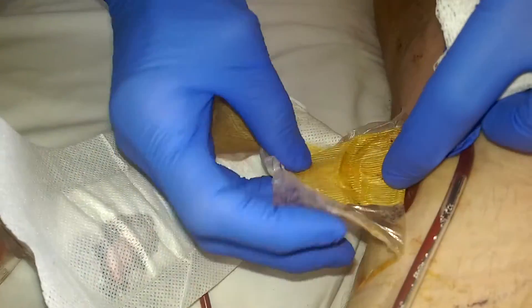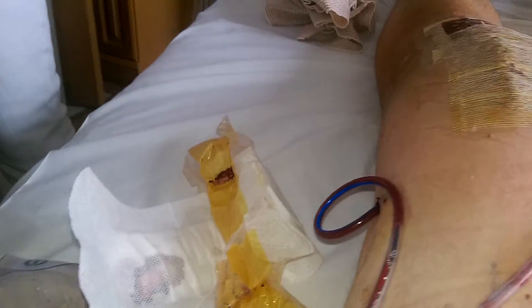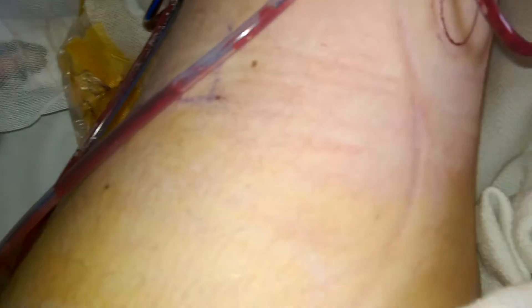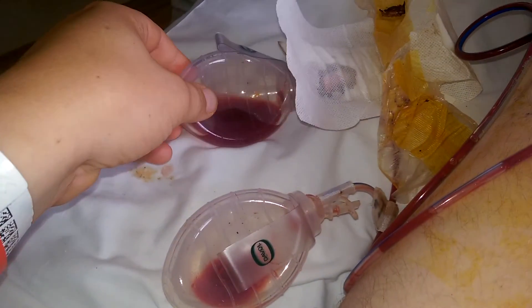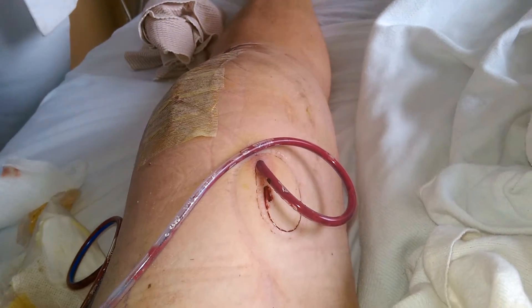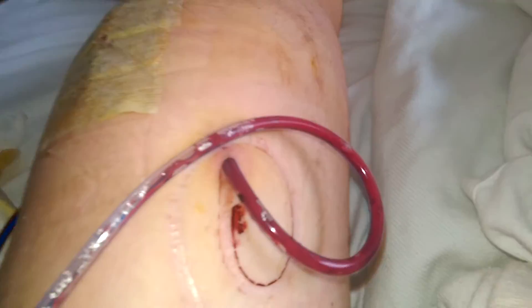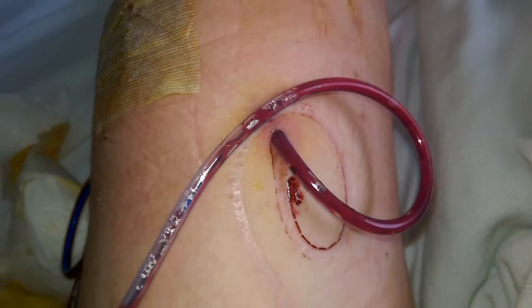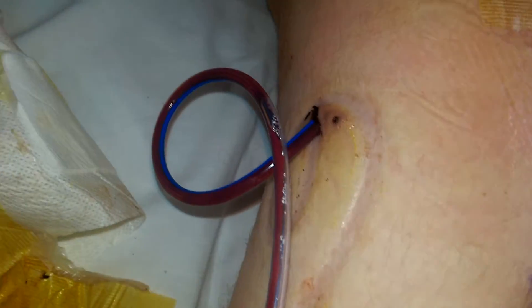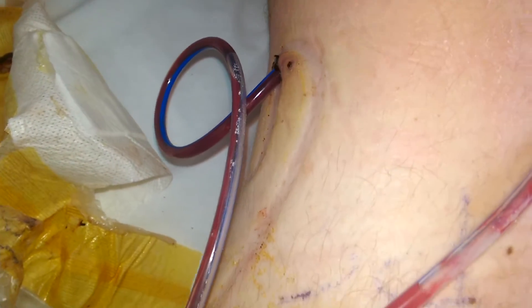This is the worst part for you, I think. I'm going to tape. Done. That is the worst part. See, so these are the drains that go inside my knee, and they drain into these little grenade-looking things. And my wonderful doctor is getting ready to pull this from inside out from my knee. We got one there and one there, which is great because these things really help with the pain because the fluid doesn't build up inside your knee.